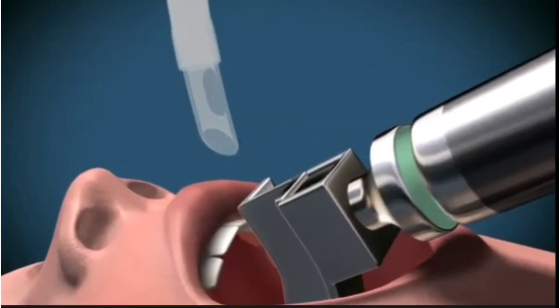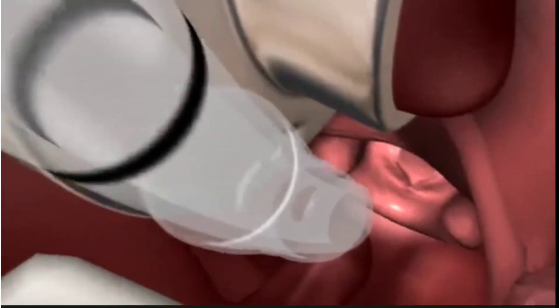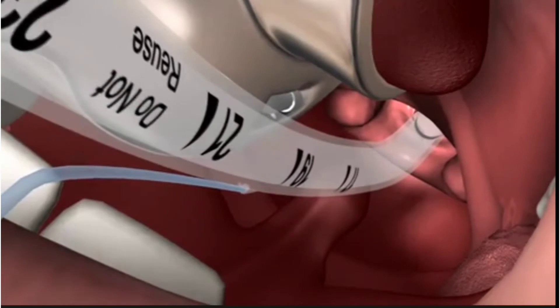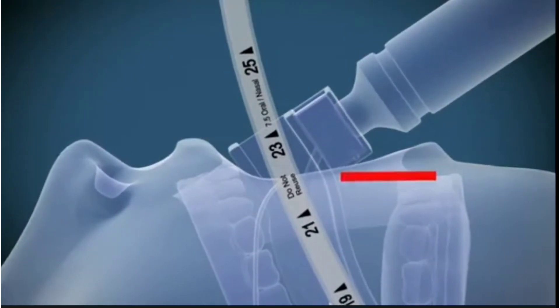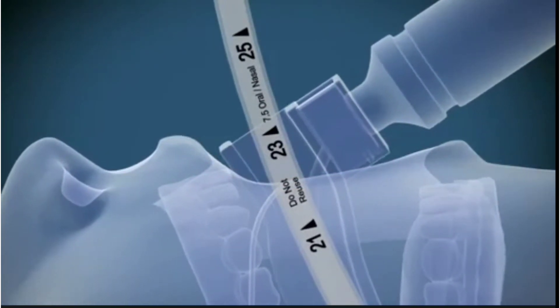With the right hand, insert the endotracheal tube from the right hand side of the mouth, directly between the cords and into the trachea until the cuff passes through the cords. The markings on the tube at the incisors will show between 21 and 24 centimetres in the average size adult when the tube is in position.